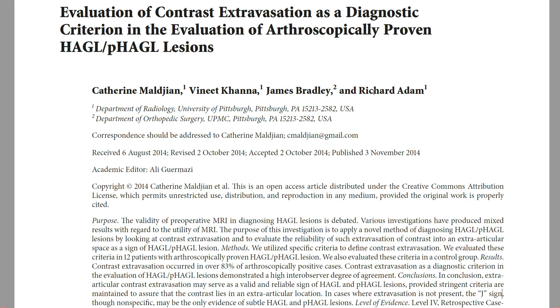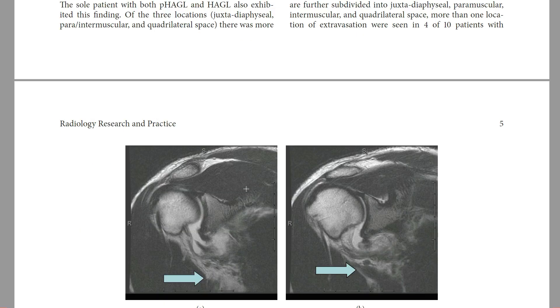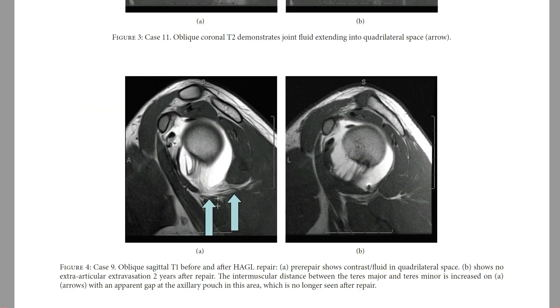Next, I would show you a study where they compared patients with arthroscopically proven HAGL lesions that had a prior MRI or MR arthrography with a control group. Most patients with a HAGL lesion had extravasation of contrast material along different sites. You can have leakage along the shaft, leakage into the teres minor, leakage into the quadrilateral space — and a pre- and post-surgery comparison emphasizes that after repair the structure is now tight. If extravasation wasn't present, patients had at least a J sign.